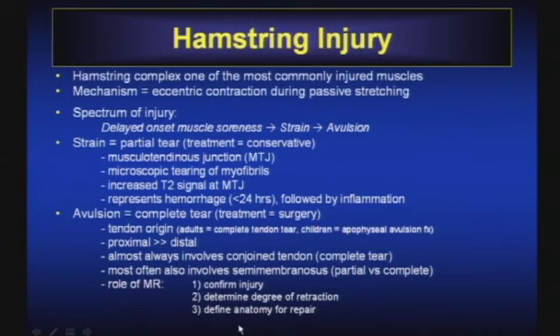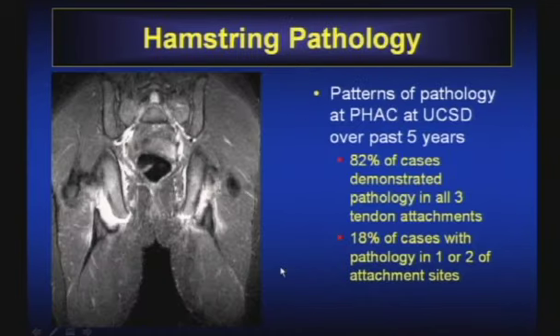One other thing about elderly patient populations is that often we'll see after a fall, there'll be a history of rule-out hip fracture, and the findings are in the hamstring, for instance, or a sacral fracture. I think especially when our older patient population encounters a fall, it's difficult for them to localize the pain to one location or another because they get muscle tears, they get injuries, so they hurt all over. So in those cases, always be careful, again, to survey and have as part of your survey analysis the hamstring.